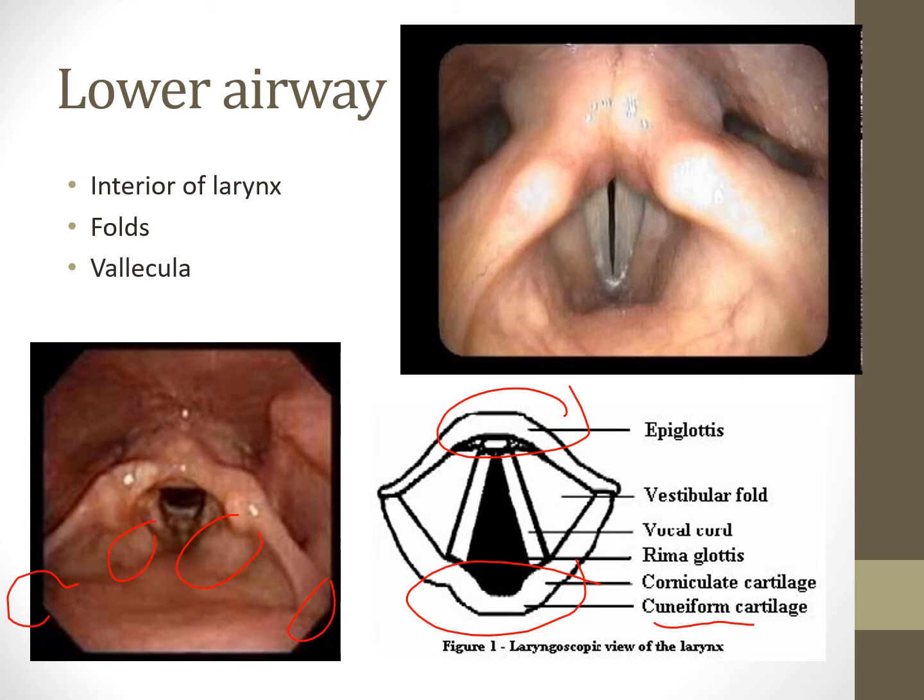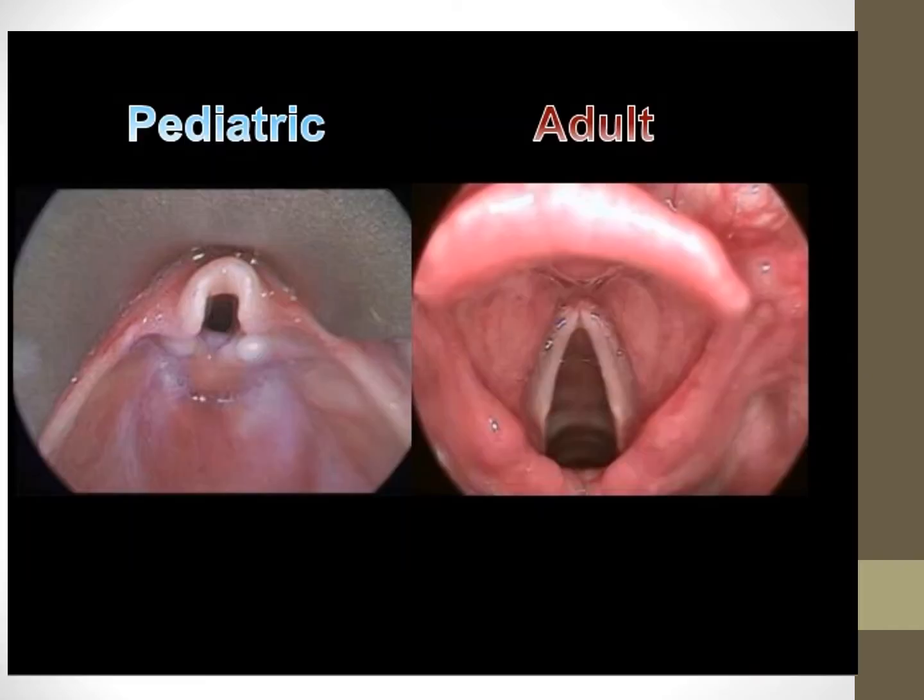So make sure you guys are familiar with all this stuff. Even when we're doing a bronchoscopy, when they go to the vocal cords, usually we'll drop 2% lidocaine on the vocal cords, right? That's something we do to help numb the vocal cords so they're not spasming or having any issues when we go down to the lower airway with that bronchoscope.